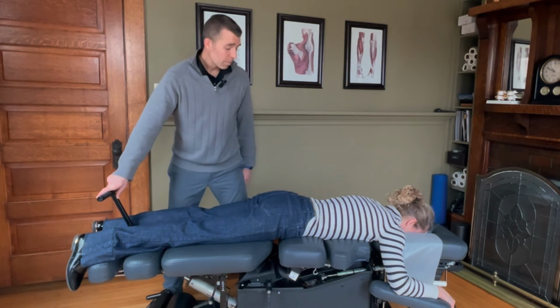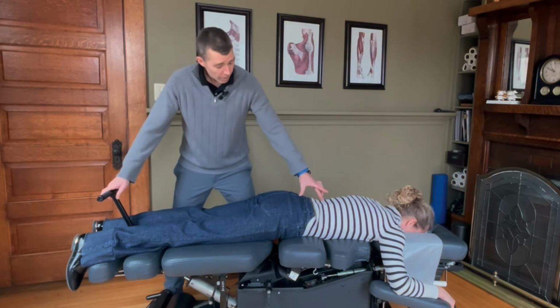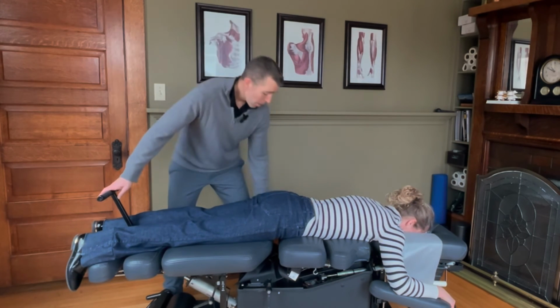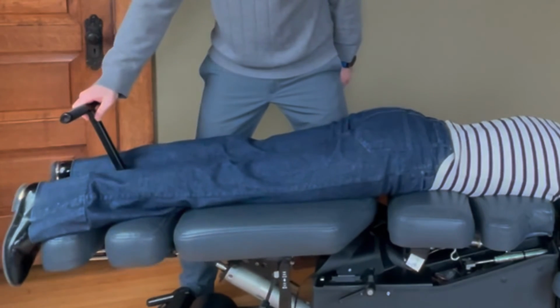Now, the other really big advantage that this type of treatment has is it has the ability not only to go up and down into this flexion extension motion, but we can also create lateral flexion motions of the spine as well.